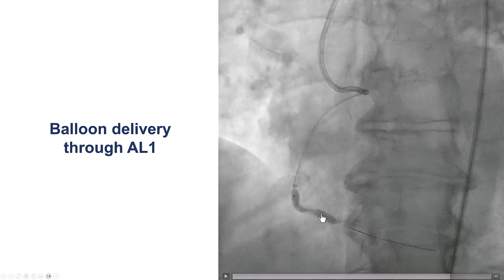Now we were able to deliver a balloon to the lesion. However, we now have a different problem, which is that the balloon is not expanding. We first had a balloon uncrossable lesion that we overcame with more support, but now we have a balloon undilatable lesion.